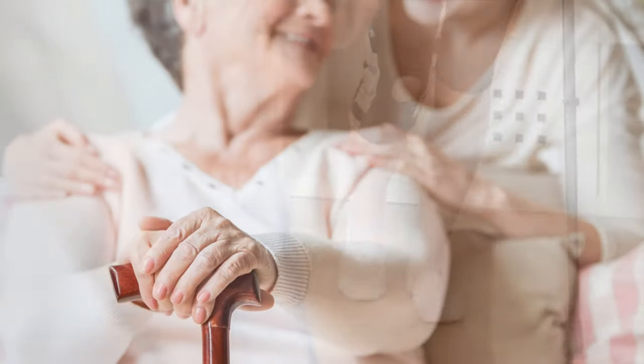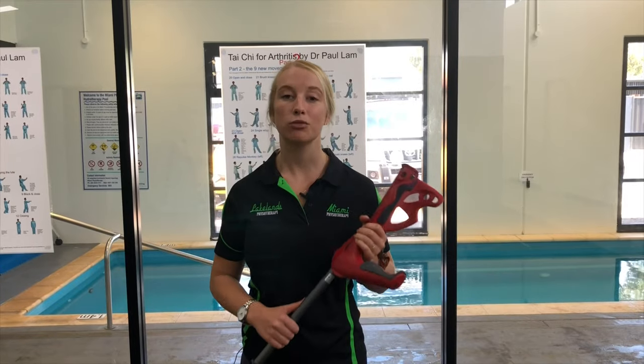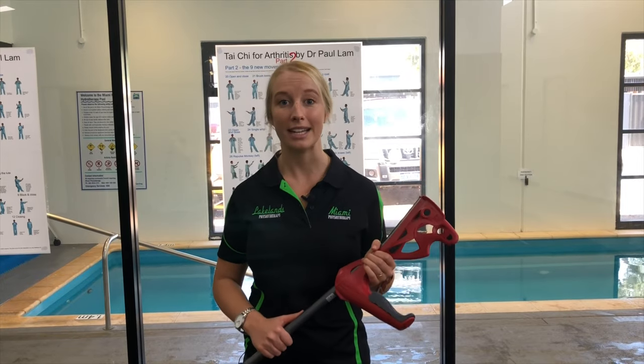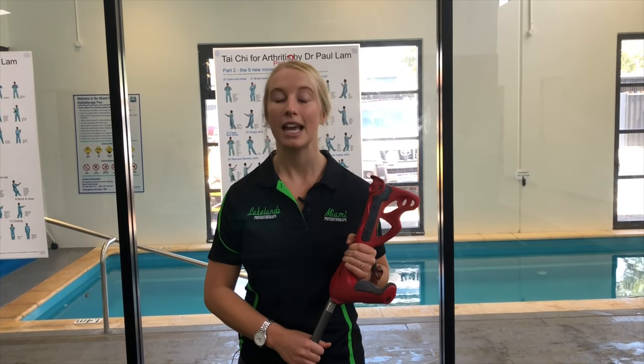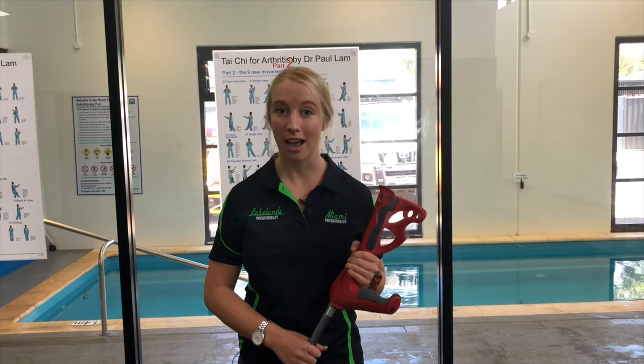Whether you're walking with a crutch or a stick for an injury or just for balance, there's a right and a wrong way to make sure that you're walking with a good pattern and that you're not creating any further damage or injuries. The most important thing when you're walking with a crutch or a stick is that it goes on the opposite side to your injured or your weaker leg.